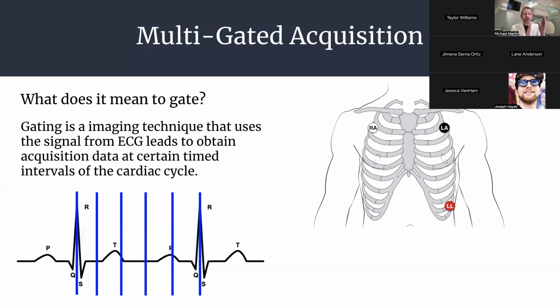Then what it's going to do is divide it up into a certain amount of images. Now, I put 5 sections here. There's 5 frames here. You're never going to do 5 frames. Most cameras do like 16 or 24 frames. I just did this for simplicity, to look at for the first time. But basically what it does is, in this case, say we have these 5 frames, it's going to take these 5 frames and it's going to assign them each.